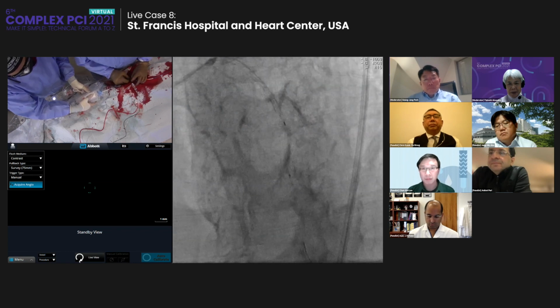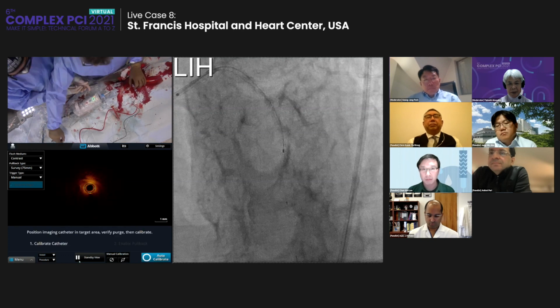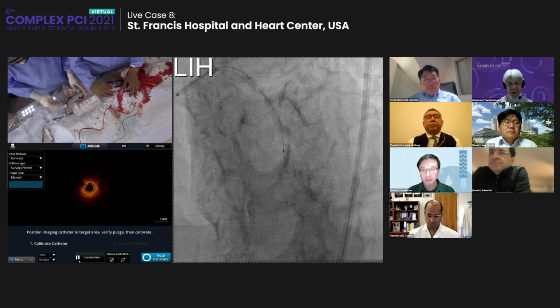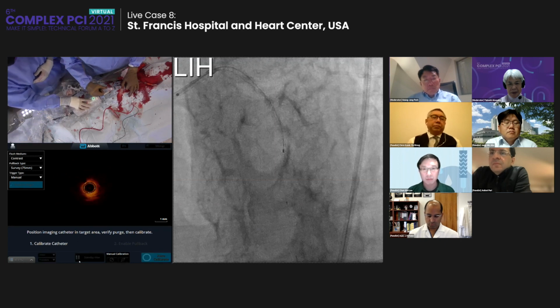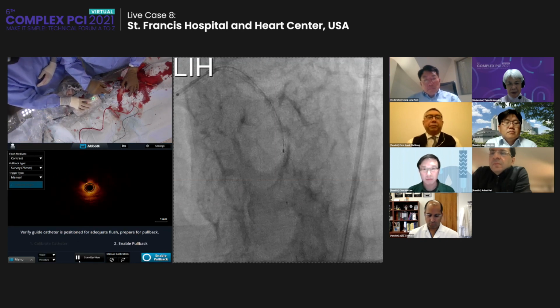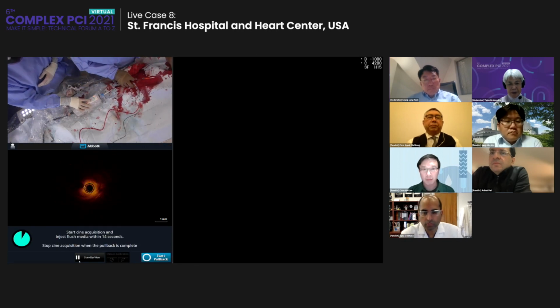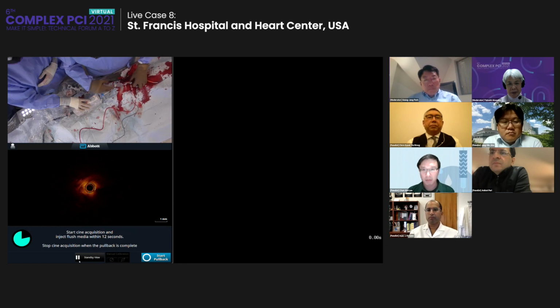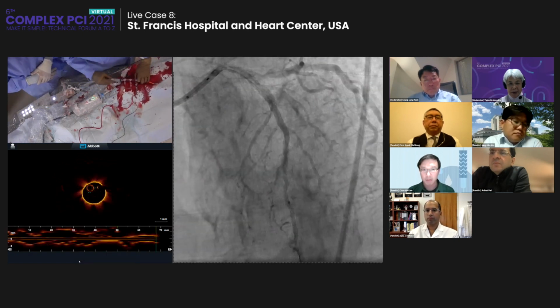You can get about 10 millimeters of mercury of blood pressure loss. That's kind of what we've seen, and that was what was found in the study. But none of them were actually hemodynamically compromising. Baseline was 200.